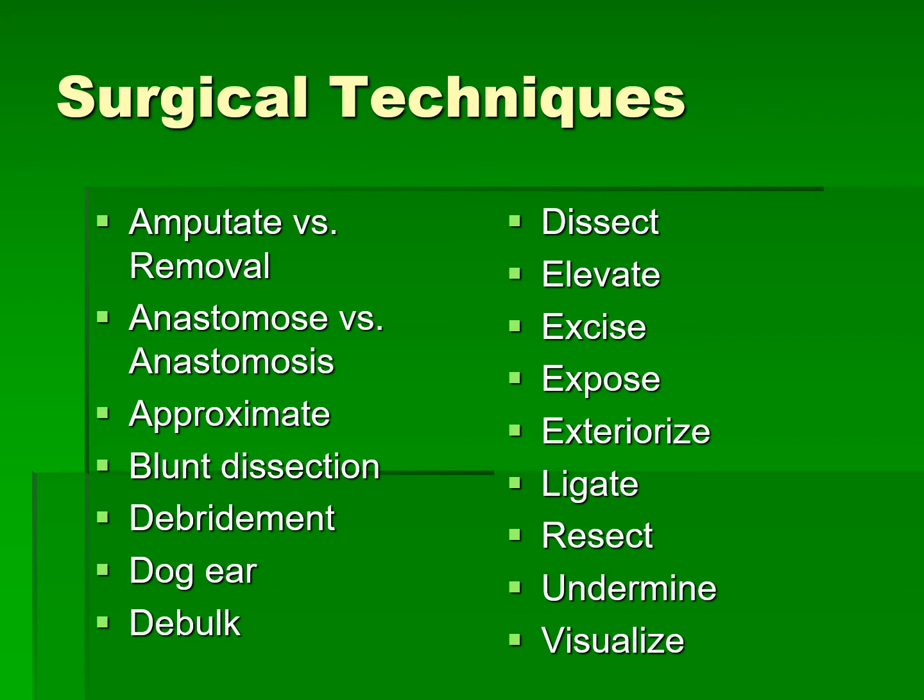And so that's why a lot of times you'll see the surgeon, before they even make the incision, draw a line where they're going to make the incision and then draw little hashes across the line. This is going to help them to line up that skin incision when they get ready to close it, so they don't end up with like a skitty-wampus closure where they have this little lump of tissue on the end because things weren't straightened out properly as they were closing the wound.